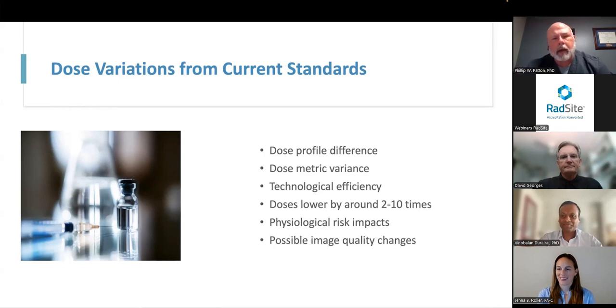We're still working through how we want to quantify the dose from CBCT as the equipment's changing. Obviously, you can actually do the same comparison using CTDI, but some of the equipment's set up where you can't actually get the same type of profile. So we have started looking at dose area product as a way of quantifying the beam along that line. But a lot of physicists still report the CTDI as our measuring tool. And as you know, if you do look at the CTDI, you're looking at a factor of approximately 5 decrease looking at a CBCT.